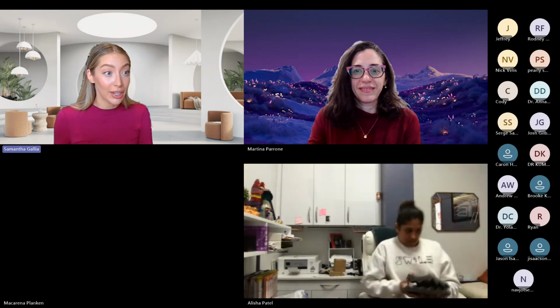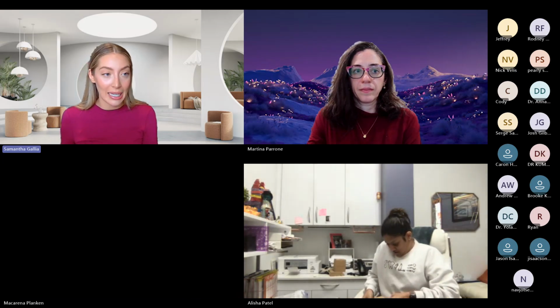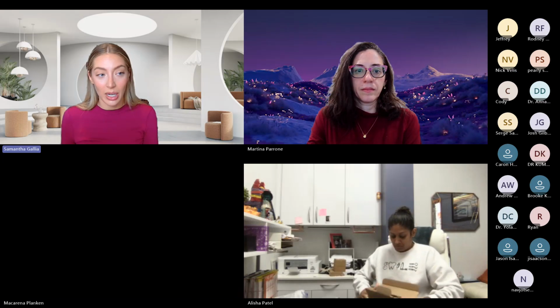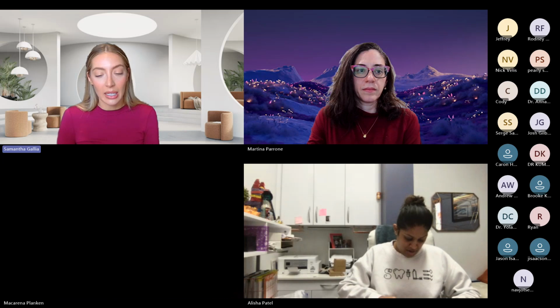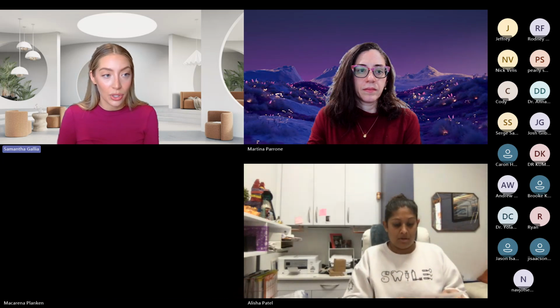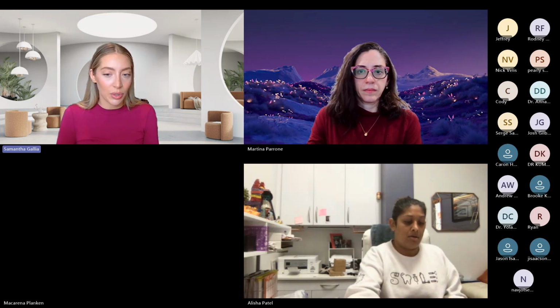My dad is actually an oral surgeon, so a lot of what I have learned about clinical practice comes from him. And I think most times that he's doing grafting he takes a CBCT, so that he can see the specific bone height and volume in the area that he's placing an implant. Sometimes it can be a small field of view if it's a single tooth, but if it's helpful and necessary, then you want to take it.